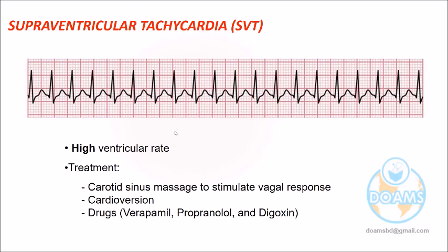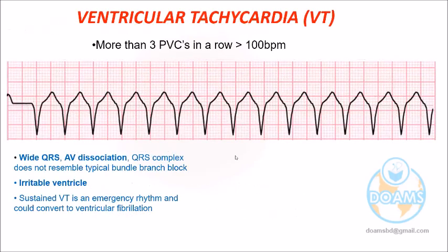So another one will be ventricular tachycardia. Yes, I was confused a little before. Now you see the QRS complex is very wide. It starts from the Q here, and there is no other wave also. Everything is covered by QRS like that. And where is R? Forget this wave pattern, rather look at the width of the complex.